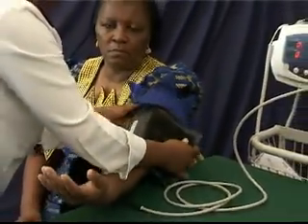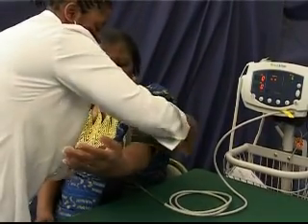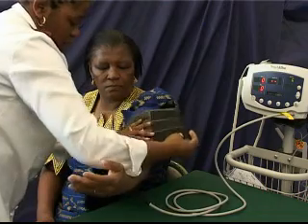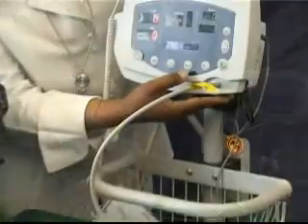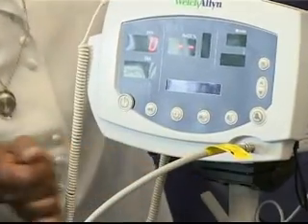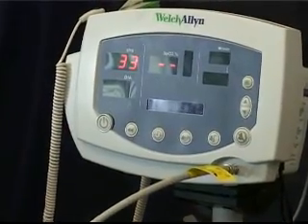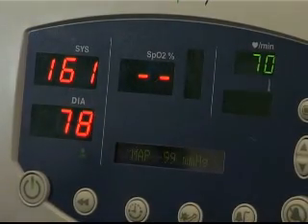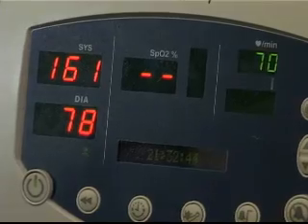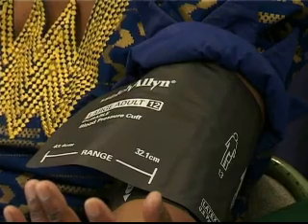Some of the units available on the market are manual, meaning that a button is pressed each time a blood pressure reading is required. Other models automatically take blood pressure readings at preset, timed intervals set by the user. Most units are available with pre-configured applications chosen by the user prior to purchase. Apart from taking blood pressure readings, pulse readings, mean arterial pressure, oxygen saturation in the red blood cells, and thermometry options can be included.